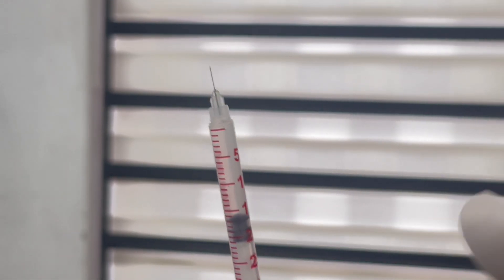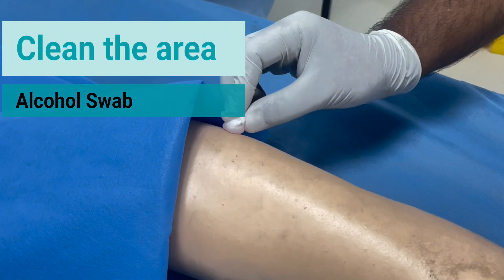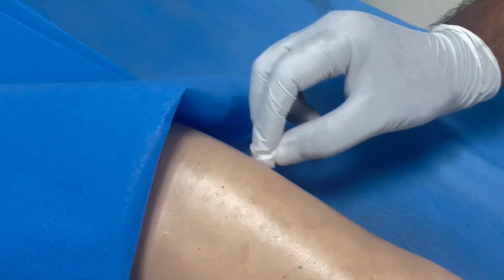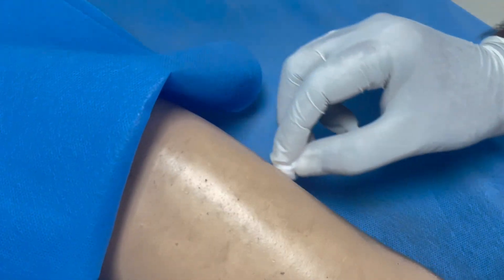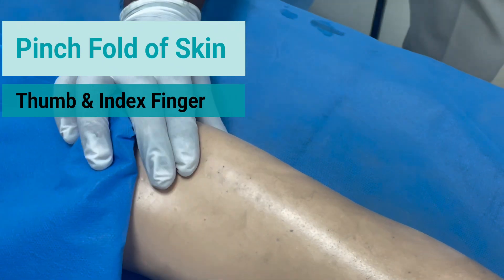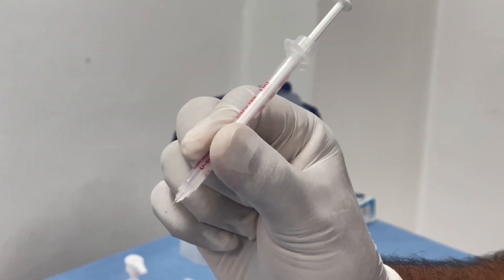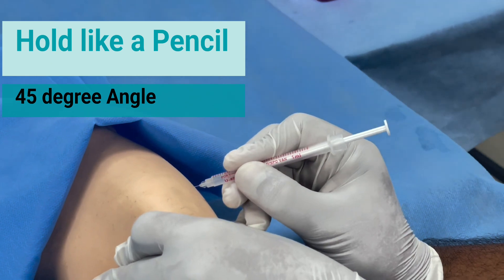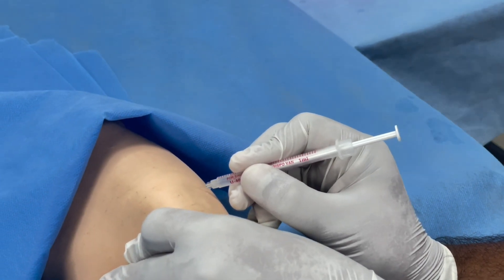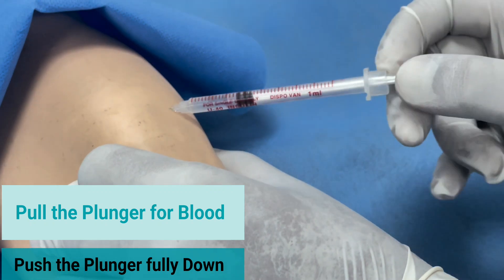Clean the area with an alcohol swab. Pinch a 2-inch fold of skin using the index finger and thumb. Hold the insulin syringe like a pencil and introduce it at a 45-degree angle.